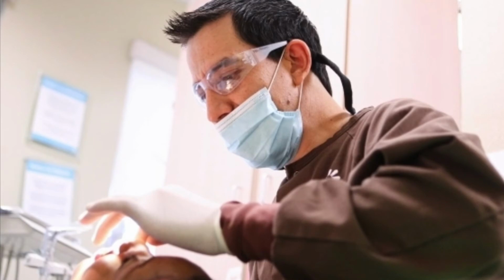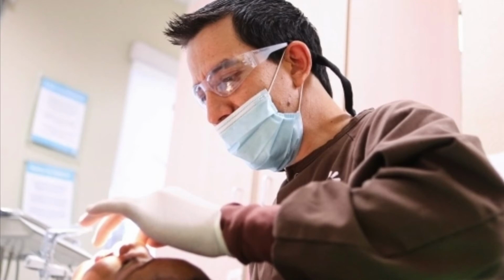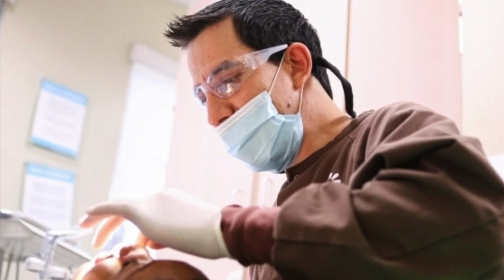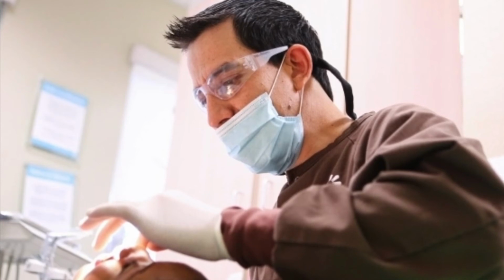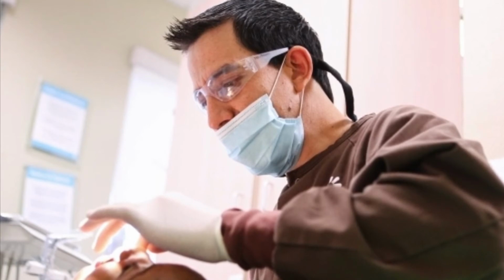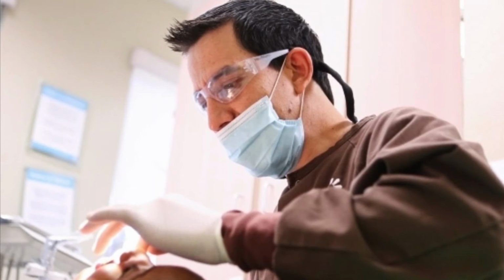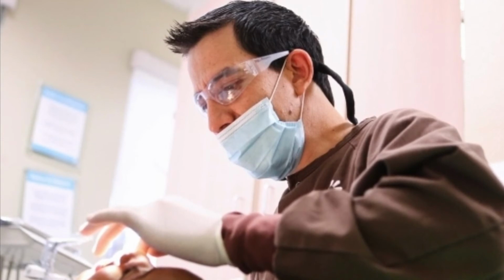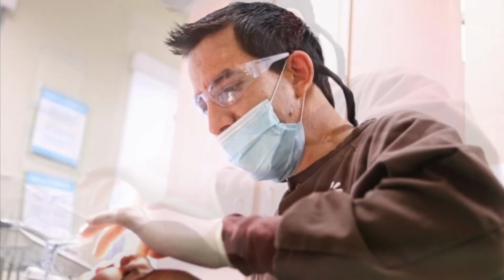Next, the buccal object rule. When treating premolars and molars, it is often difficult to recognize radiographically which canal is nearer to the buccal side. So, what do we do if we cannot recognize which canal is nearer to the buccal side? We have one lingually, one buccally, and we don't know which one is the palatal one and which one is the buccal side.